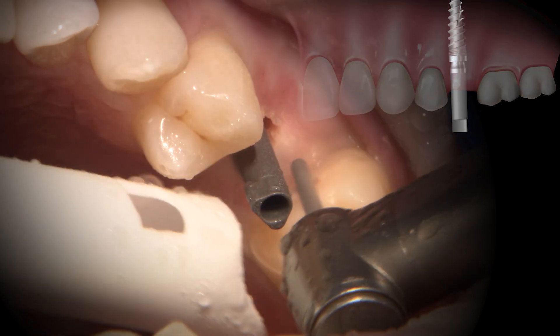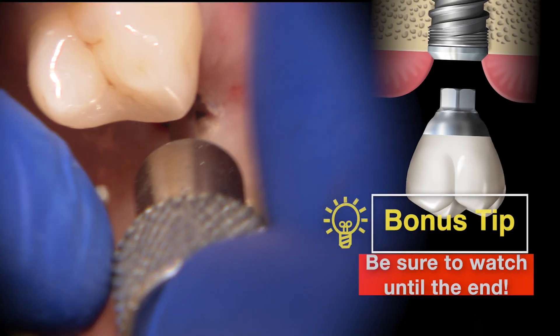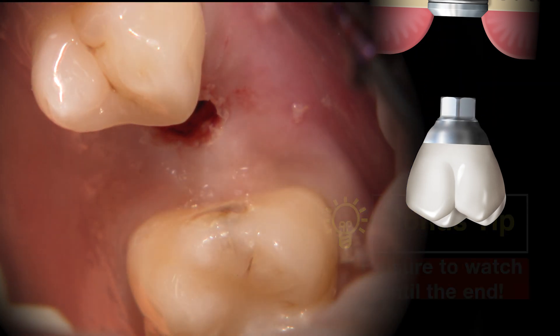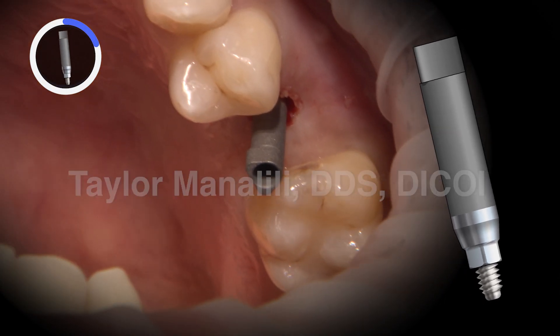These planes should be parallel to the long axis of the implant, which is represented here by the scan body. My plan for this restoration is a screw-retained crown. This is a straightforward restoration and wonderful for long-term maintenance. A major concern for a screw-retained implant restoration is the path of insertion.